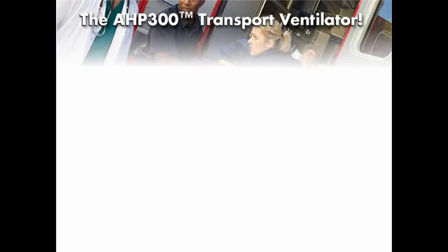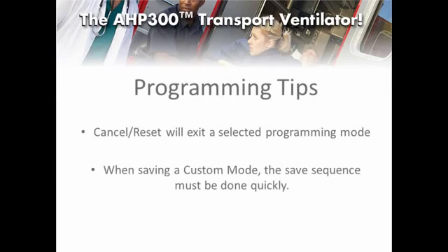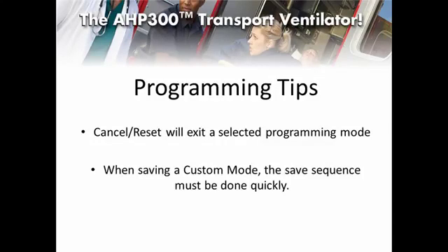Custom modes 2 and 3 can be programmed using the same process used for custom mode 1. Here are some final tips: at any time during a programming sequence, pressing the cancel/reset button will exit you from that programming mode without saving your settings. Therefore, if you get an alarm during programming, it's best to allow it to occur and save your program before cancelling the alarm. On the custom modes in particular, the save sequence must be done within 2 seconds, or else it will exit out of programming mode without saving. Be ready to press and hold the custom mode select button and then immediately press the mode selection button to ensure your settings are saved.